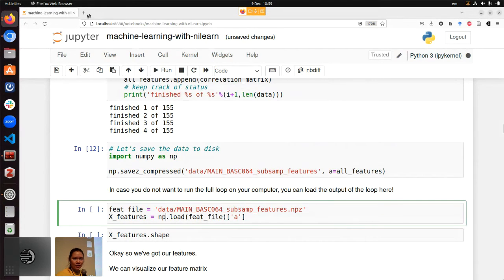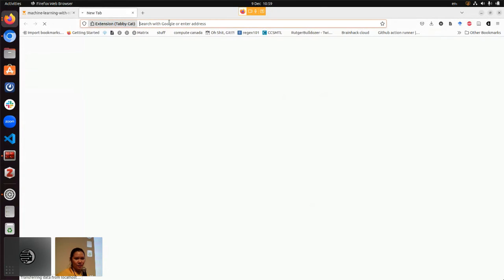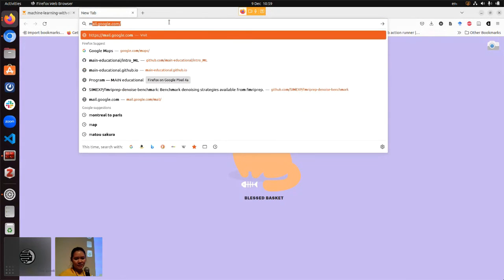And meanwhile, we can go back to the website to show you what is going on.